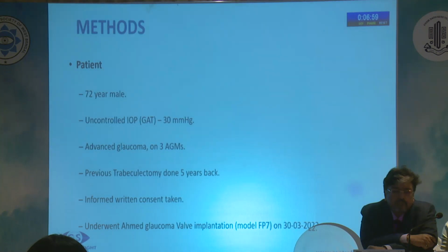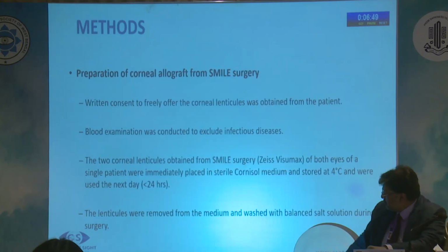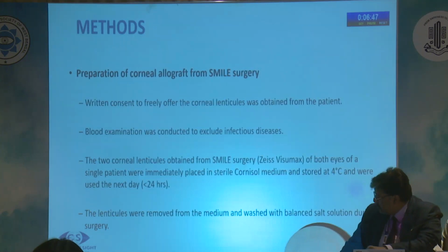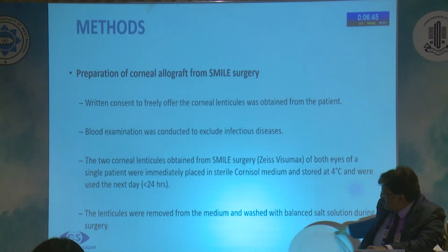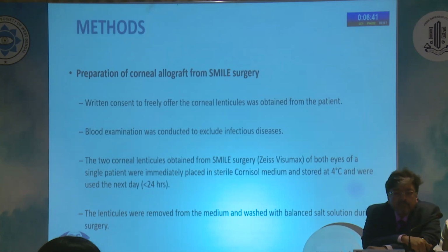A 72-year-old male with uncontrolled glaucoma and history of failed trabeculectomy underwent Ahmed glaucoma valve implantation. A different patient underwent SMILE surgery and 2 corneal lenticules were obtained from him. Relevant blood investigations and informed consents were obtained.